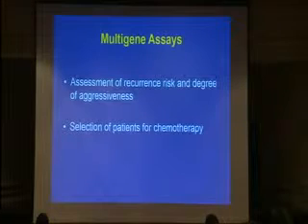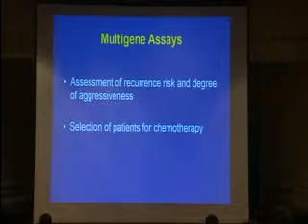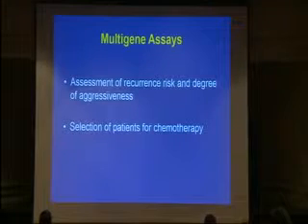All right, so back to the assays that can incorporate all the biomarkers and all the molecular technology that we have, and give us a score that can tell us, is this patient going to benefit from a specific type of treatment or not? So basically, these are predictive assays. They are used by clinicians, of course, especially in hormone receptor positive patients, to help them decide whether to add chemotherapy or not.